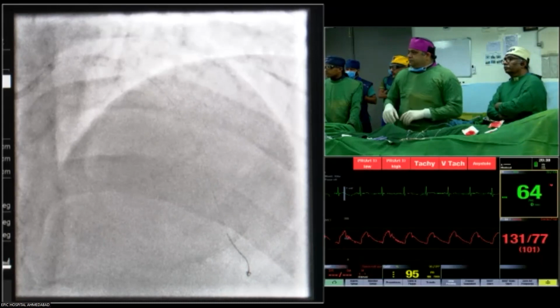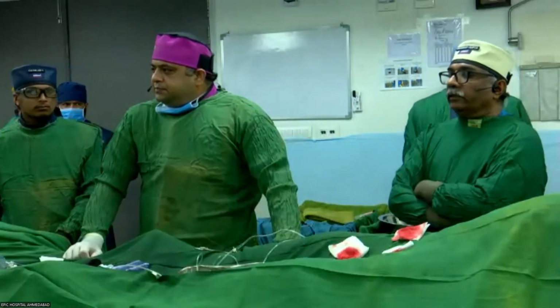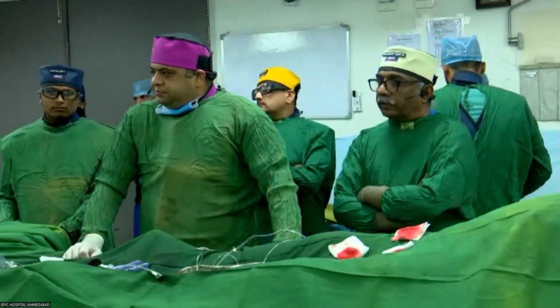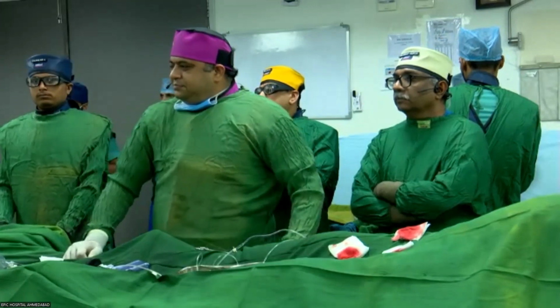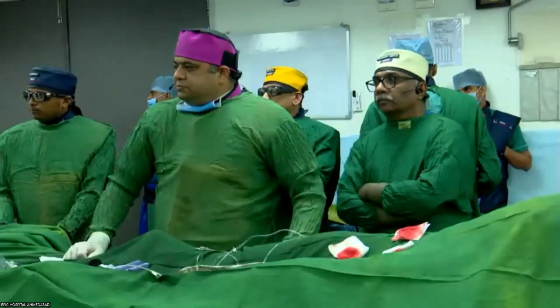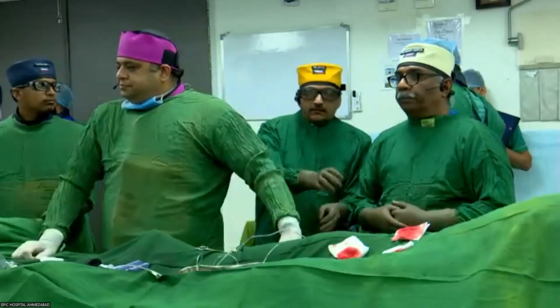So thank you, Dr. Gupta. We really thank you very much for showing this case. I think OCT looks good. There is a 2 to 3 millimeter stent inside the left main. I think that is fine. We accept that. There is no dissection. Everything looks very good. You post-dilated. You did a POT already. Thank you very much for this demonstration. Any final words, Dr. Gupta?